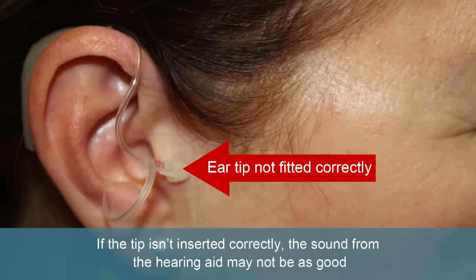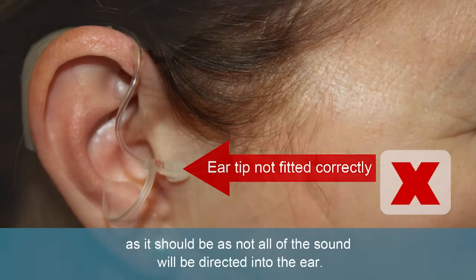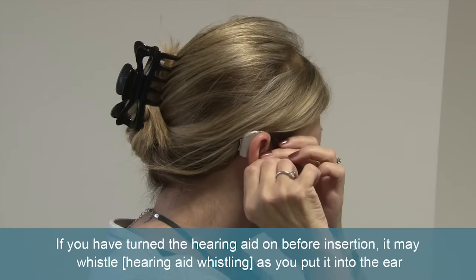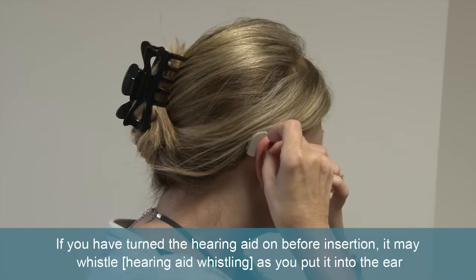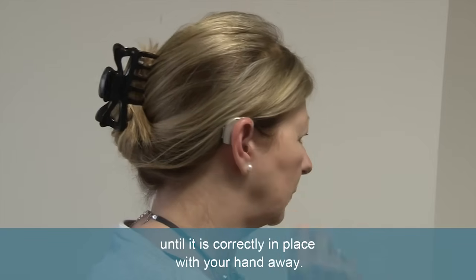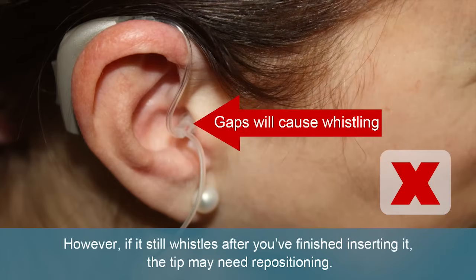If the tip isn't inserted correctly, the sound from the hearing aid may not be as good as it should be, as not all of the sound will be directed into the ear. If you have turned the hearing aid on before insertion, it may whistle as you put it into the ear until it is correctly in place with your hand away. However, if it still whistles after you have finished inserting it, the tip may need repositioning.